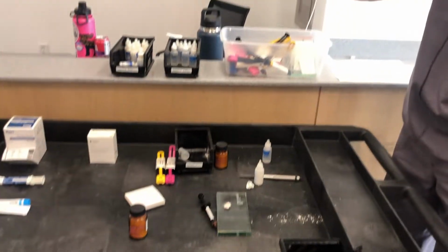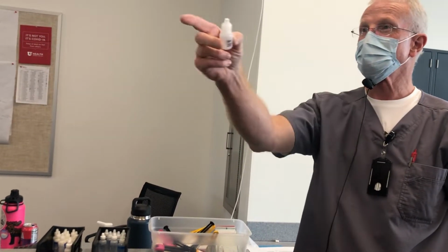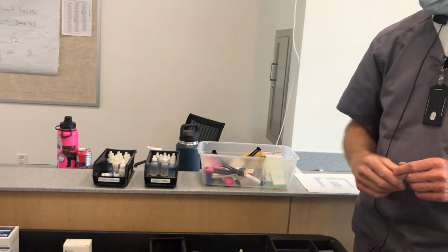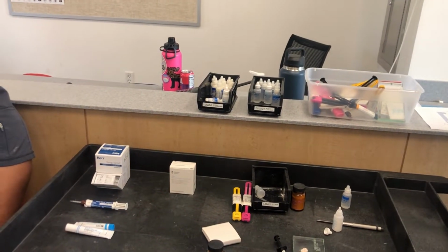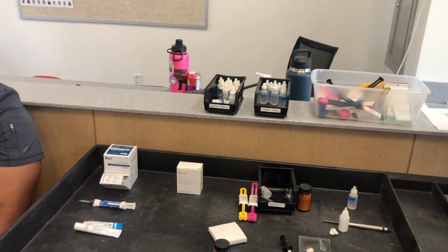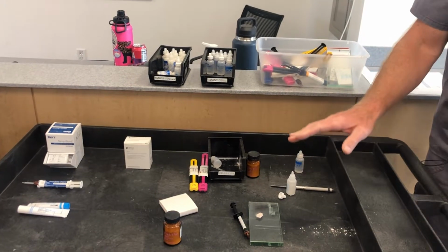The nice thing about this is it's liquid. It's just distilled water. Yes. So if it was originally designed to be like a real permanent cement, and you use it in a temporary, how hard is that to get the temporary off? It's harder. Is it pretty stuck? Yeah. And there's a weak bond to the tooth structure.